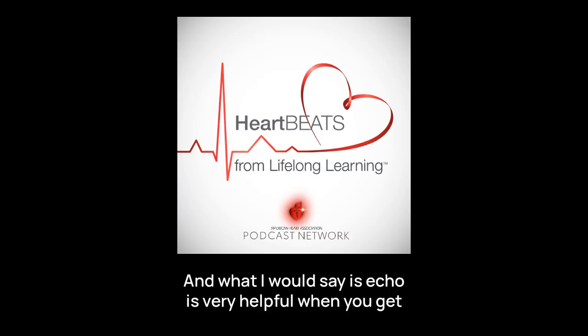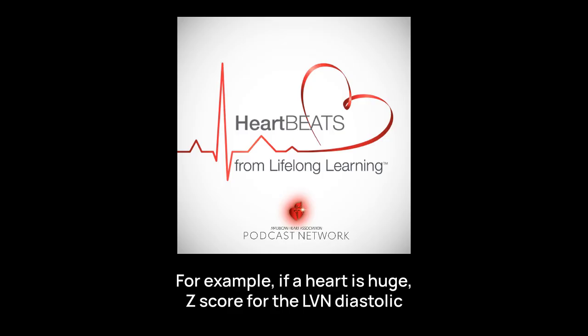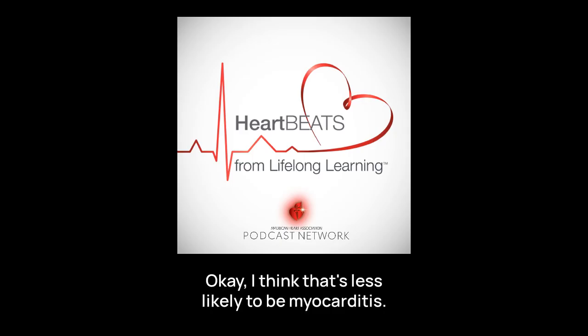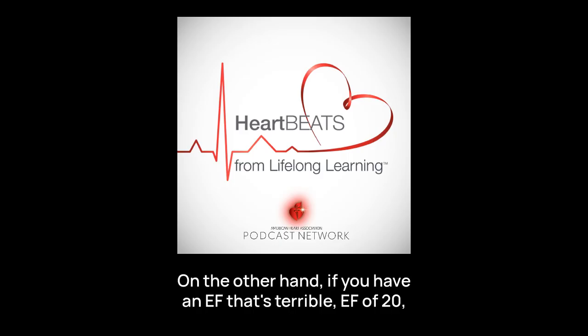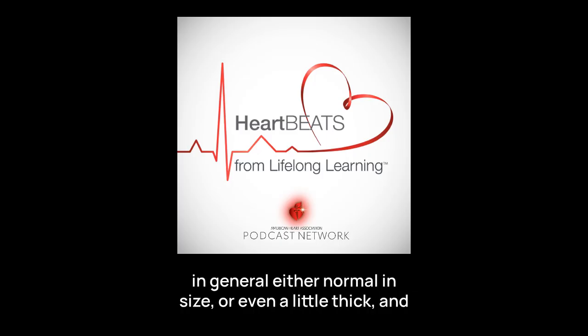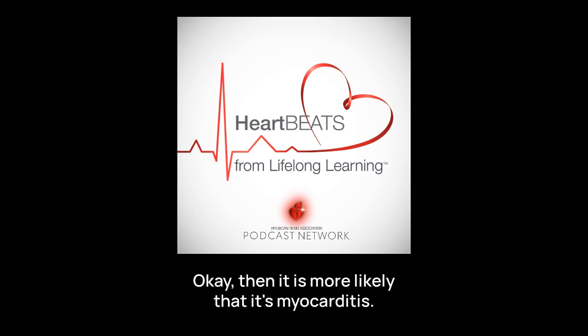What I would say is echo is very helpful when you get past the initial screening. For example, if a heart is huge, the Z-score for the LV end diastolic dimension, let's say above 4, 5, 6, and the walls are really thin, I think that's less likely to be myocarditis. On the other hand, if you have an EF that's terrible, EF of 20, 30, even 40%, but the heart's not dilated, the LV walls are in general either normal in size or even a little thick, and maybe a touch of echo density suggesting maybe an edema, then it is more likely that it's myocarditis.